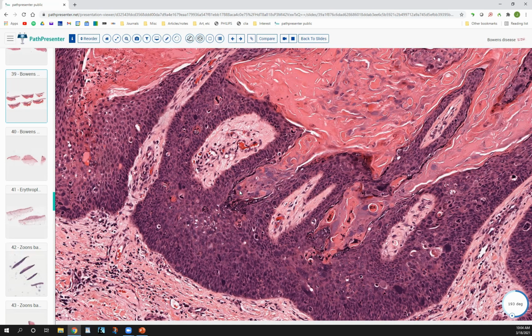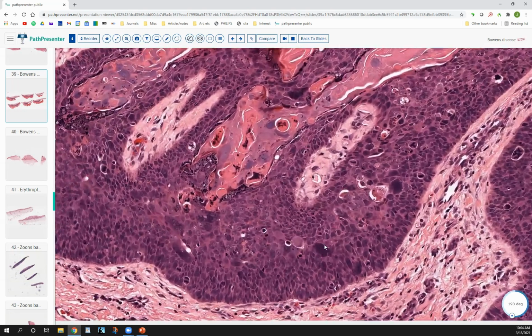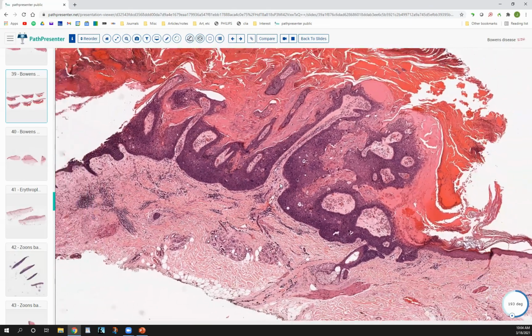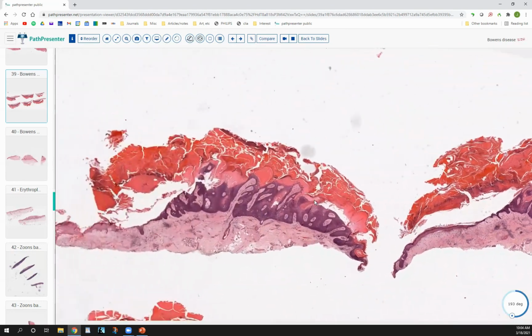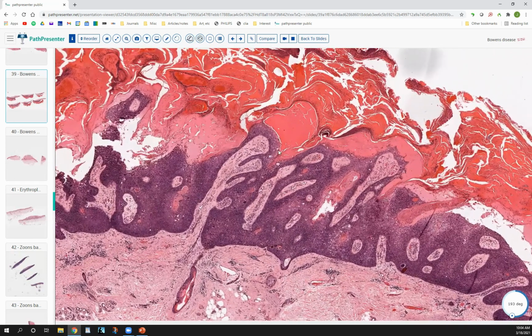We're not going to be talking too much about this except maybe some of the variants because you see a lot of these. And this is a very abnormal process. You can see overlapping nuclei, as I was saying. No problem recognizing nuclear pleomorphism, hyperchromasia. And sometimes these apoptotic bodies, these scattered dyskeratotic cells, are a nice clue as well. So full thickness atypia, you get less sparing of the adnexal structures compared to an actinic keratosis. This thing kind of just bulldozes over everything, and you have atypia from one side all the way to the other. So that's one thing you can use to distinguish the two, besides the obvious full thickness atypia.